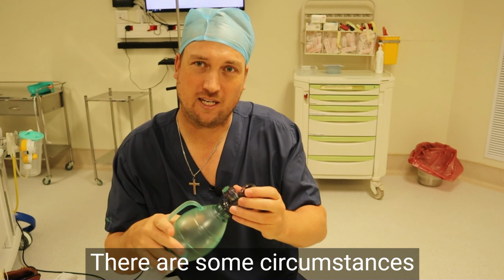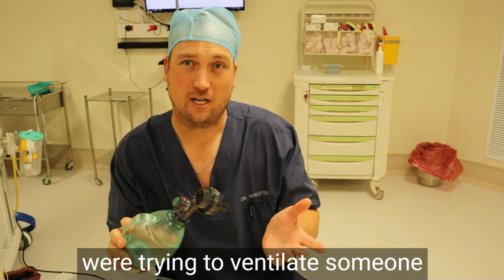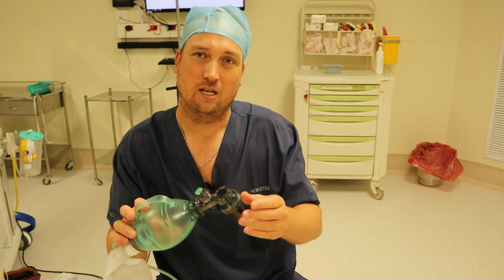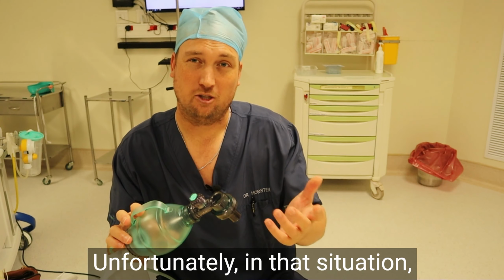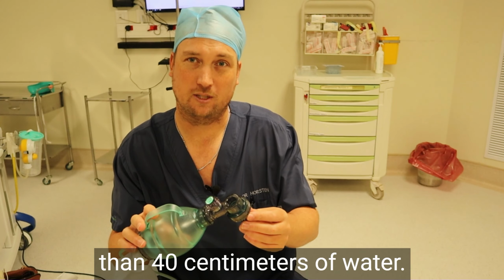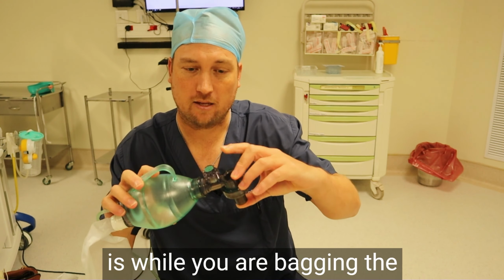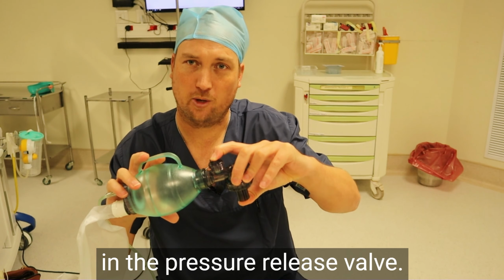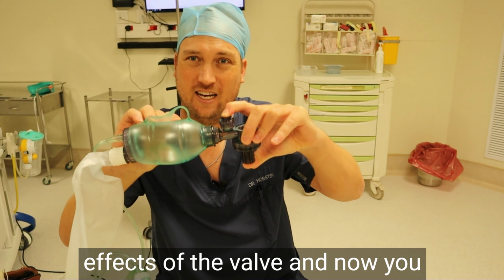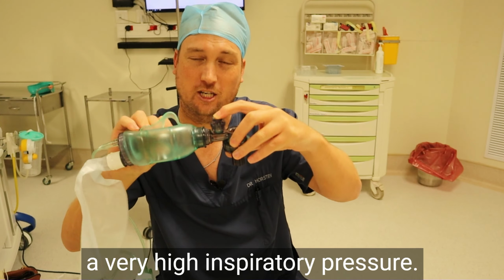So that's a safety feature on this ambu bag to prevent you from causing barotrauma to the lungs. There are some circumstances though where that might cause some problems. For example, if you were trying to ventilate someone who had acute bronchospasm, unfortunately in that situation you might need to use inspiratory pressures of more than 40 centimeters of water. What you can do then, while you are bagging the patient, is hold in the pressure release valve. That basically negates the effects of the valve. And now you can see that I'm able to generate a very high inspiratory pressure.